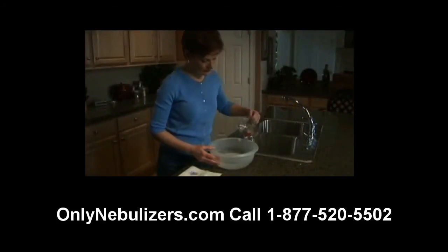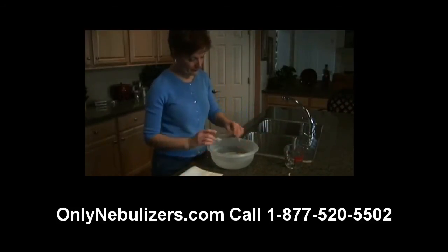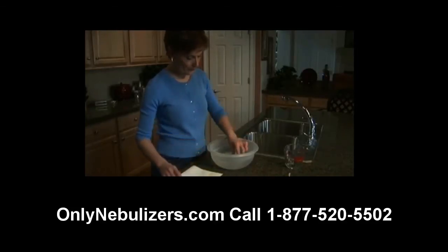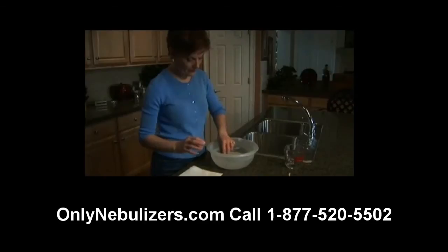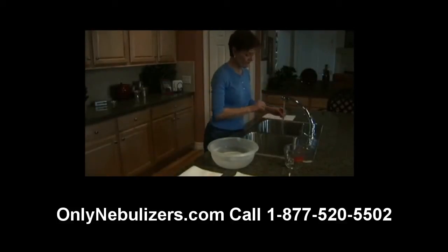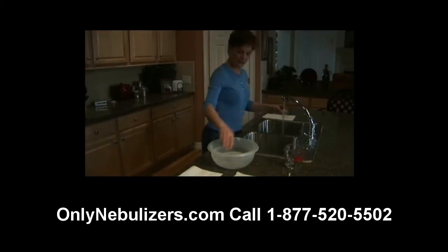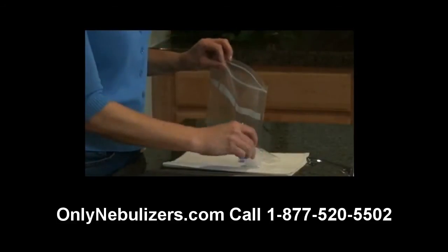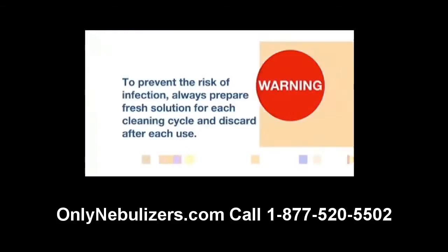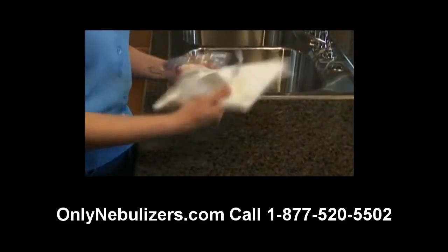Do not towel dry nebulizer parts to avoid the potential for contamination. On a daily basis, you'll also need to disinfect your nebulizer. This is accomplished by soaking your disassembled nebulizer in a clean container or bowl containing three parts hot water and one part white vinegar for 30 minutes. Or you can use a medical bacterial germicidal disinfectant available through your medical provider. With clean hands, remove the nebulizer parts from the disinfectant solution, rinse thoroughly under hot tap water, and allow to air dry on a clean paper towel. Store the parts in a sealable plastic storage bag. Always prepare fresh solution for each cleaning cycle and discard after each use. Keep the outer surface of the tubing free of dust and grime by wiping regularly.